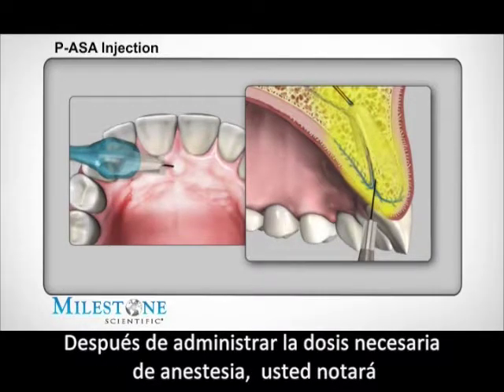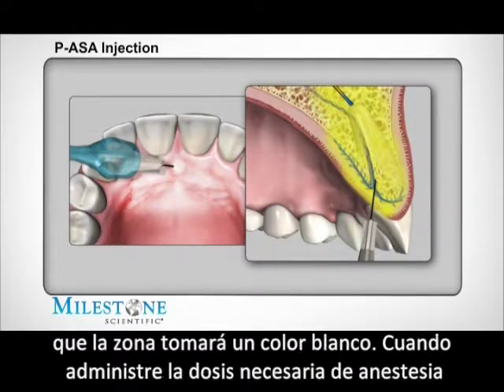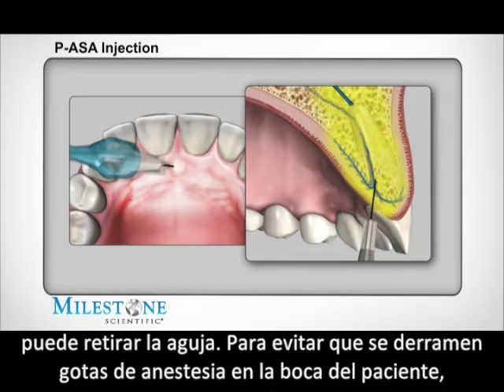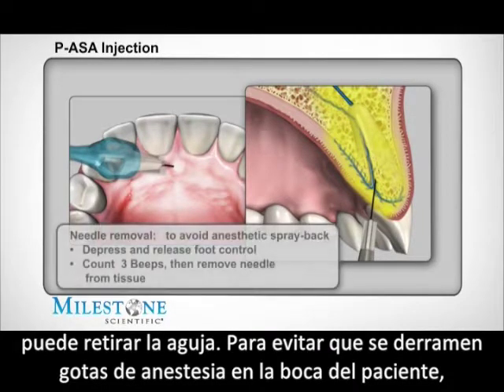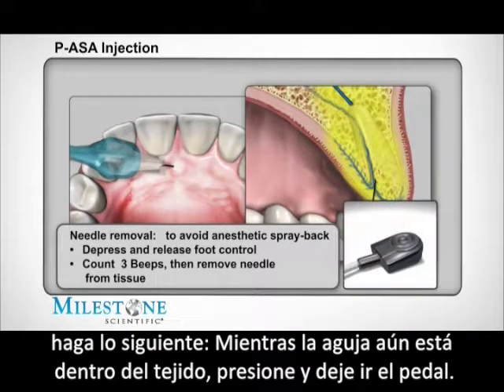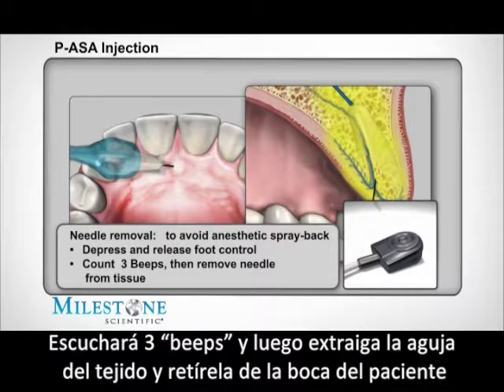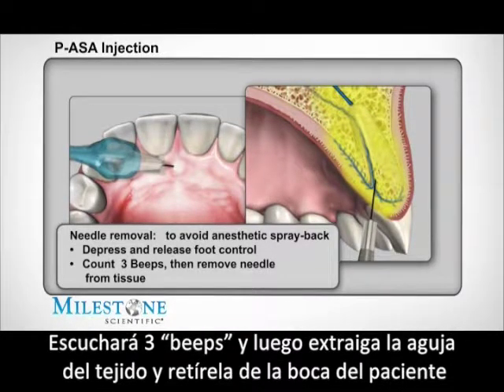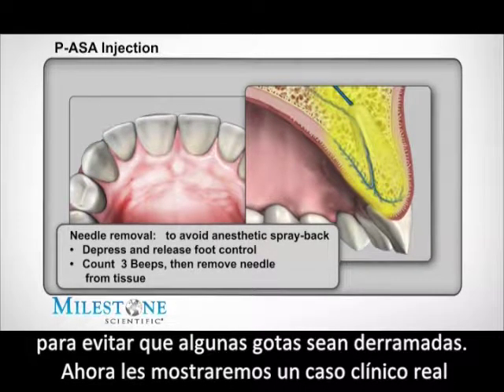After you've delivered the proper amount of anesthetic, you will notice diffuse blanching of the tissue. Once the suggested volume of anesthetic solution is dispensed, the needle can be removed. To avoid anesthetic spray back during needle removal, use the following technique: while the needle is still embedded in the patient's tissues, depress and release the foot control pedal, count three beeps after releasing the foot control, and then totally remove the needle from the patient's mouth. Direct the needle away from the patient as a small amount of anesthetic solution may still be present.